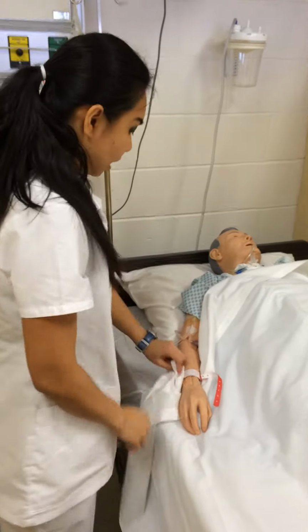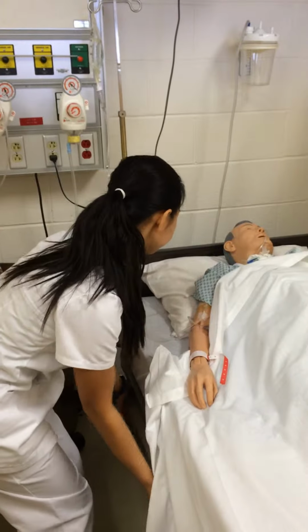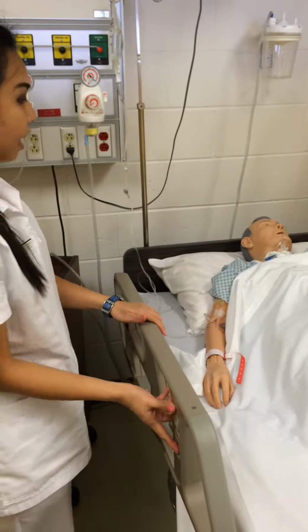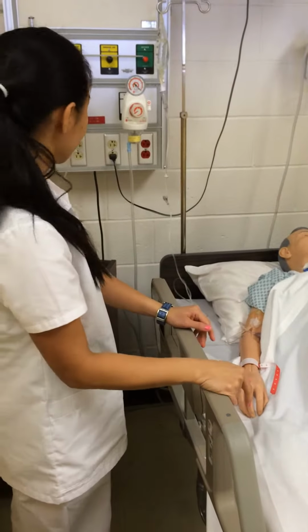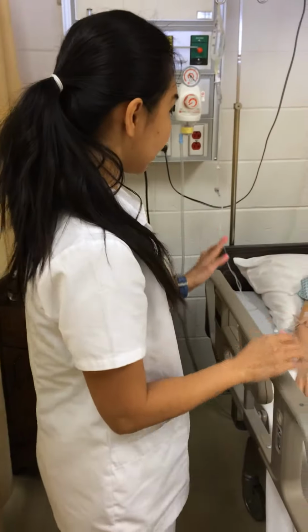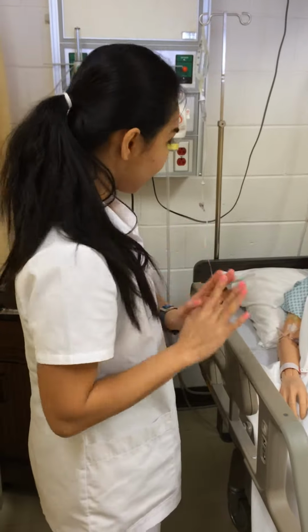Okay. After I change the gown, make sure the patient is comfortable. Raise the bed rail up, lower the bed down, call bell in reach, and I document. And I wash my hands, and I finish.